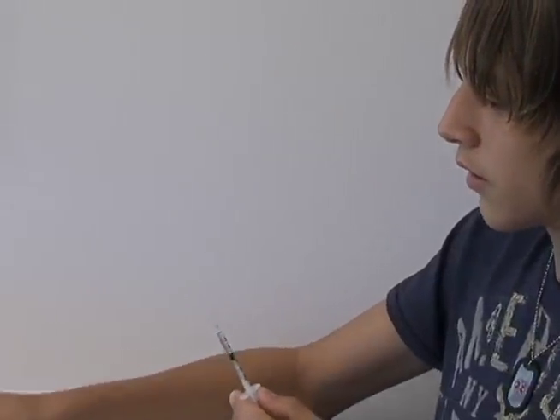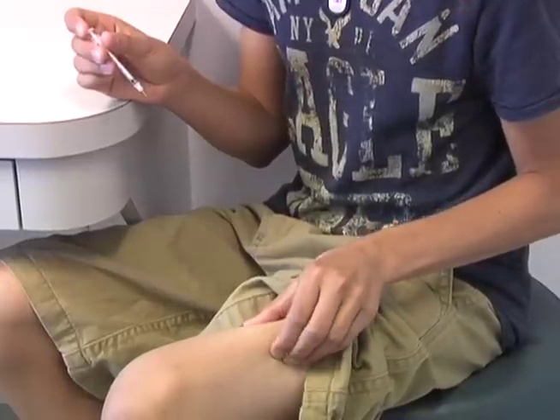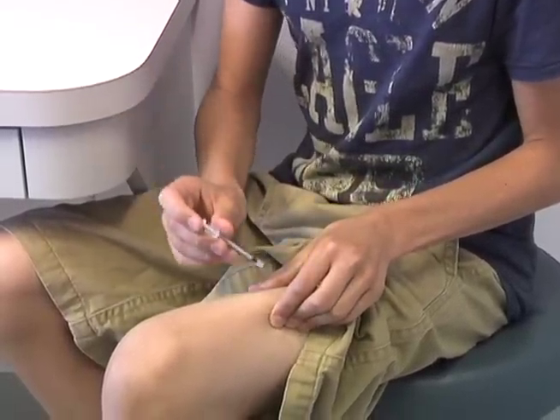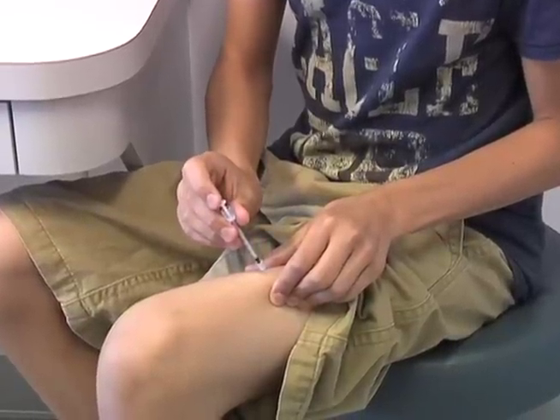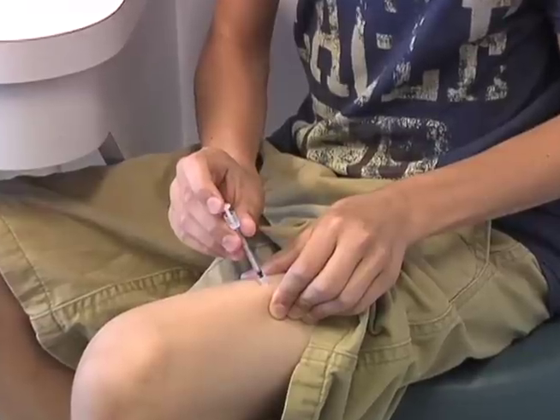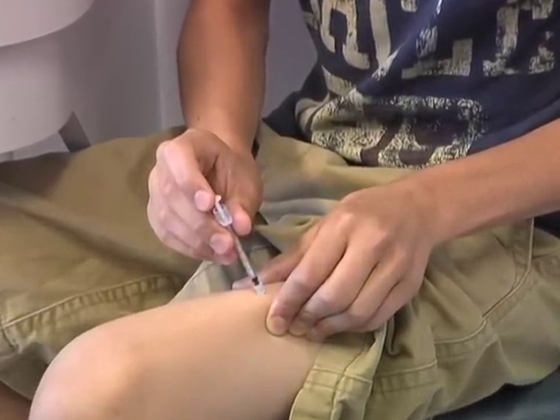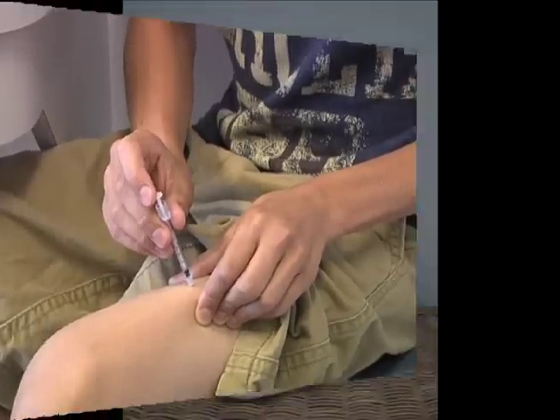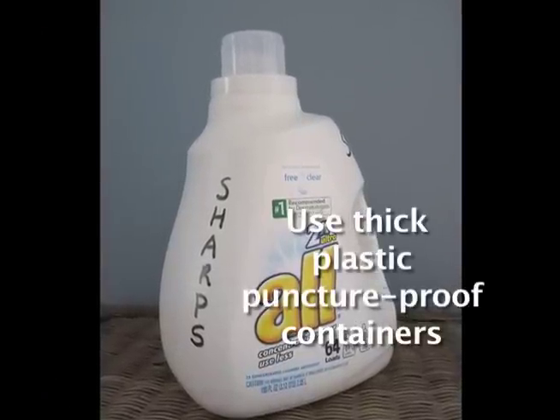Make sure the injection site is clean. Inject into fatty tissue. Depending on the amount of fatty tissue and the length of the needle, gently lifting the skin may help to keep the tip of the needle in the fat instead of the muscle. Wait about 5 to 10 seconds before taking the needle out of the skin — waiting helps prevent insulin from leaking out. Dispose of the syringe in an appropriate puncture-proof sharps container.